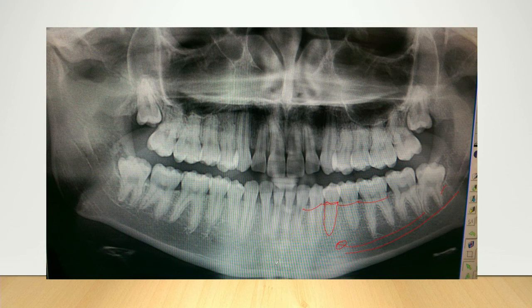Just don't do a mesial relieving incision and you'll be safe, okay? And if you have to, then do a distal relieving incision, yeah? When you're removing bone, just remove bone up to about halfway down the root. Don't go any further. Sometimes your nerve will come out somewhere along this kind of position, a lot higher than what you see here. So make sure that you don't go any further than your tooth. Remove buccal bone is fine. Remove interseptal bone is fine.